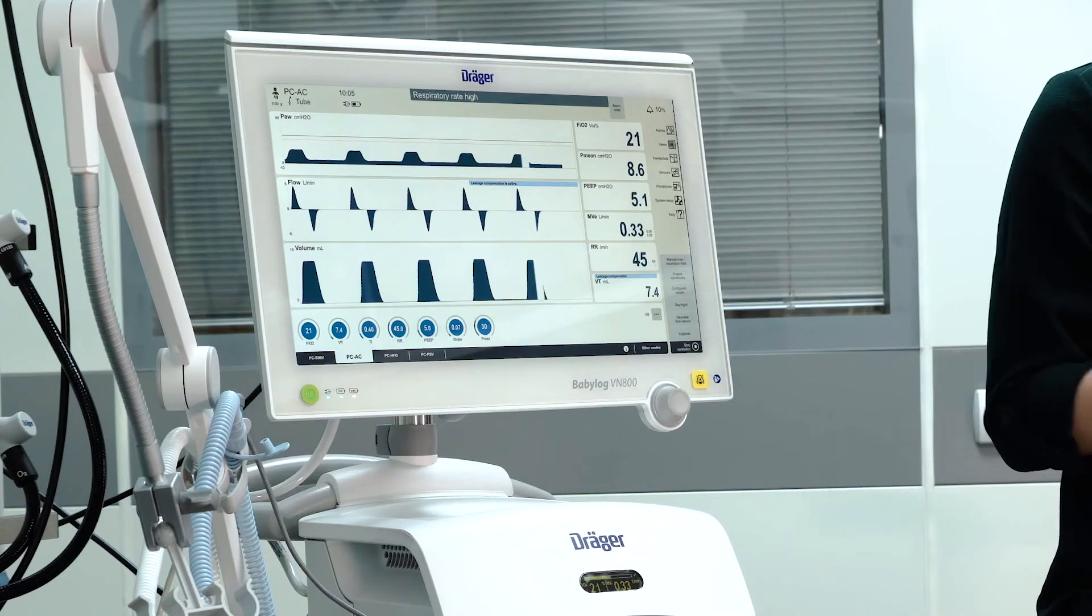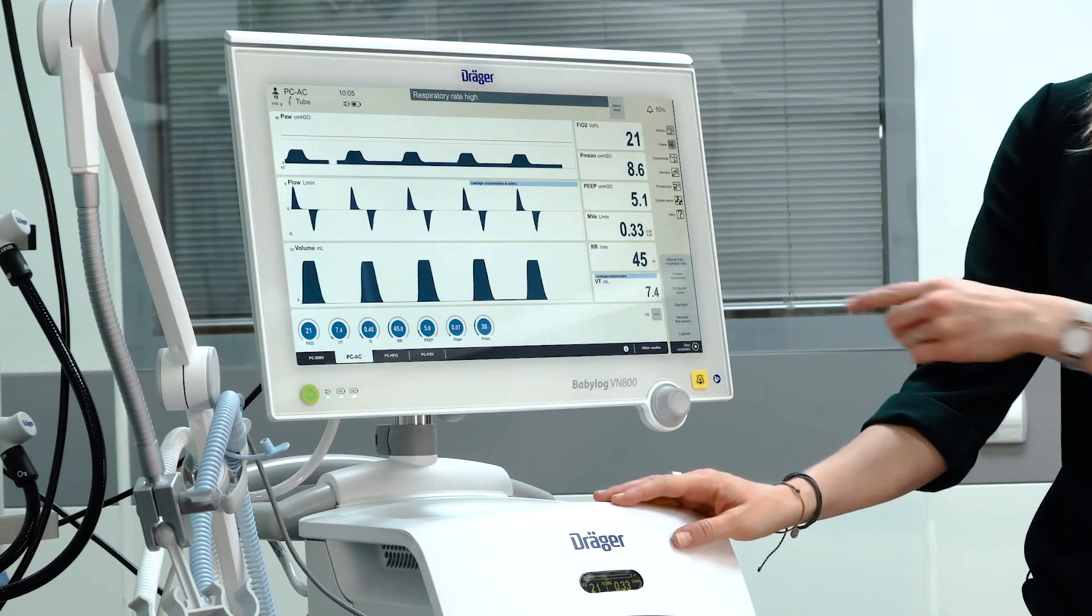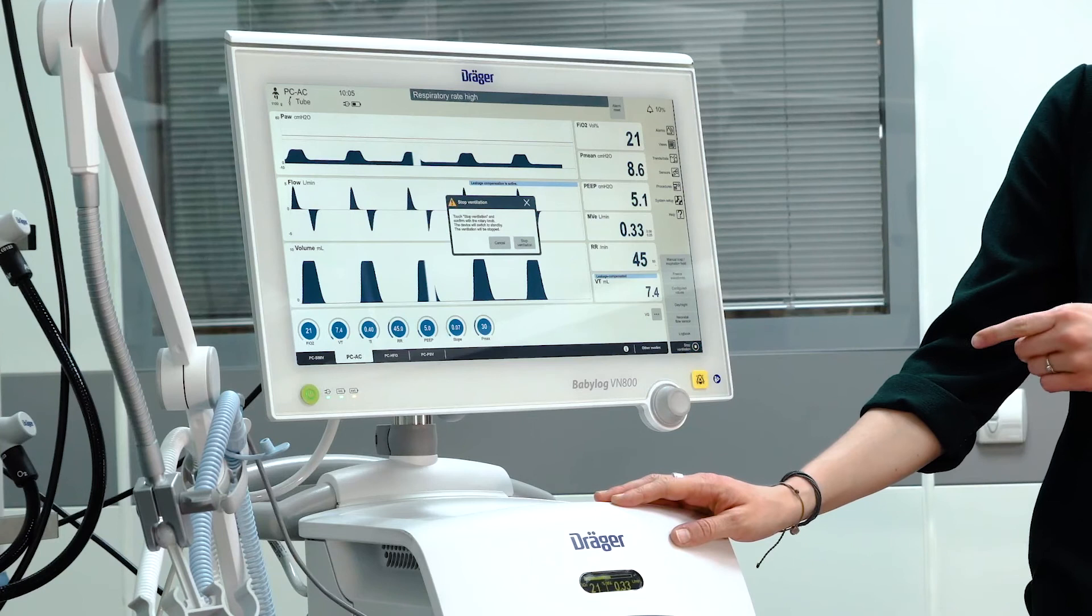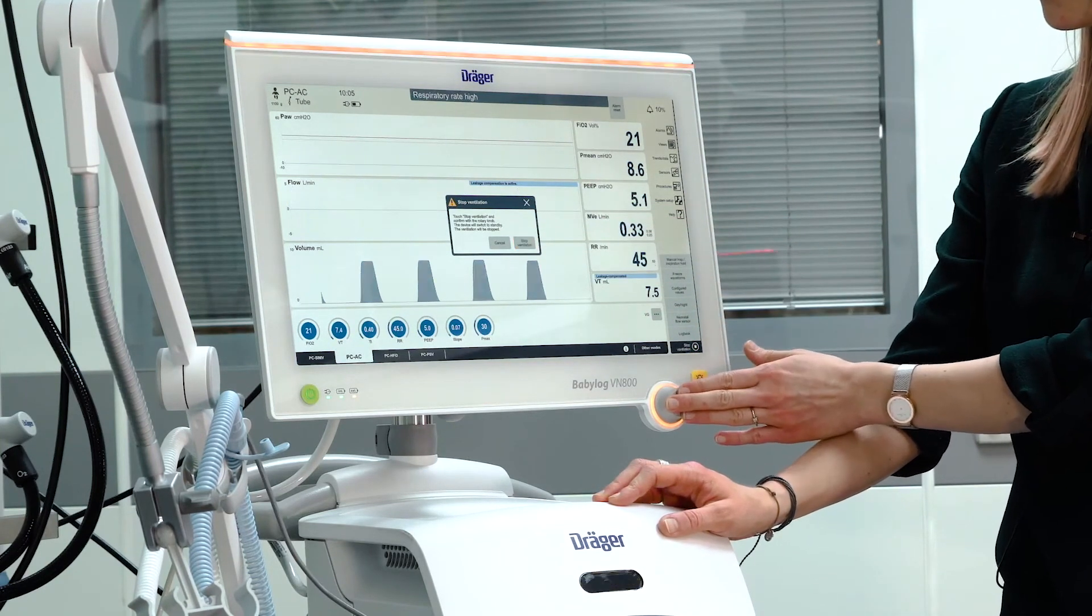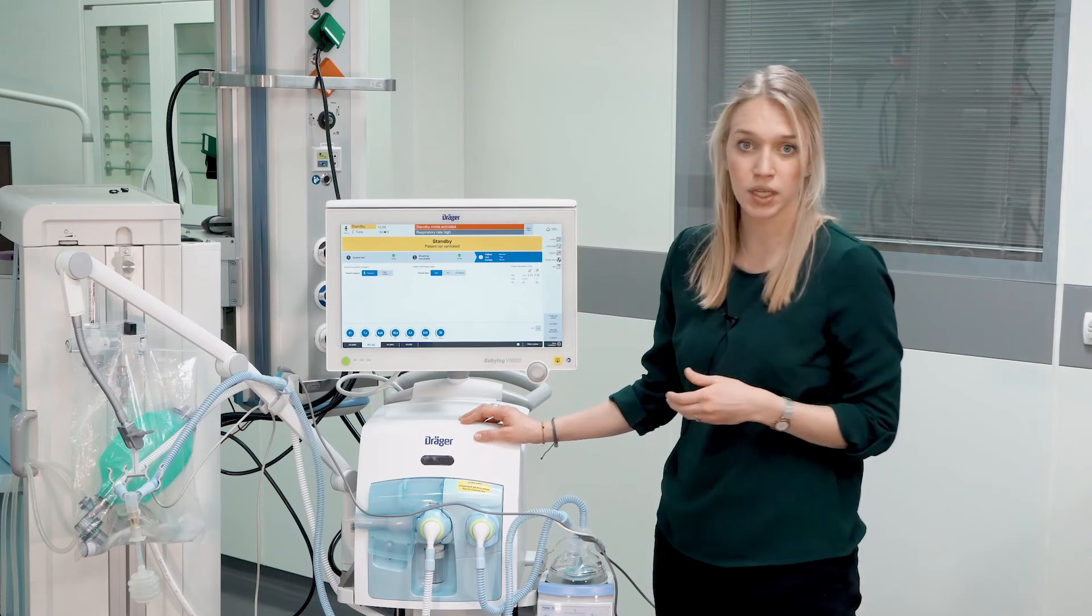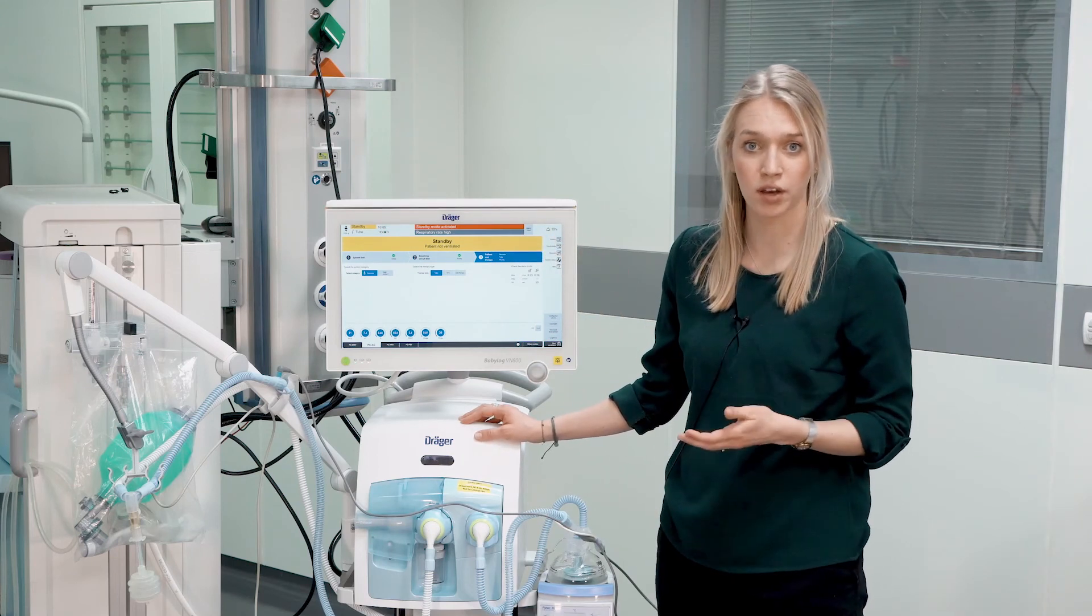If you want to end ventilation therapy in general, press on stop ventilation and confirm by pressing the rotary knob. The red alarm will indicate that the patient is now no longer ventilated.